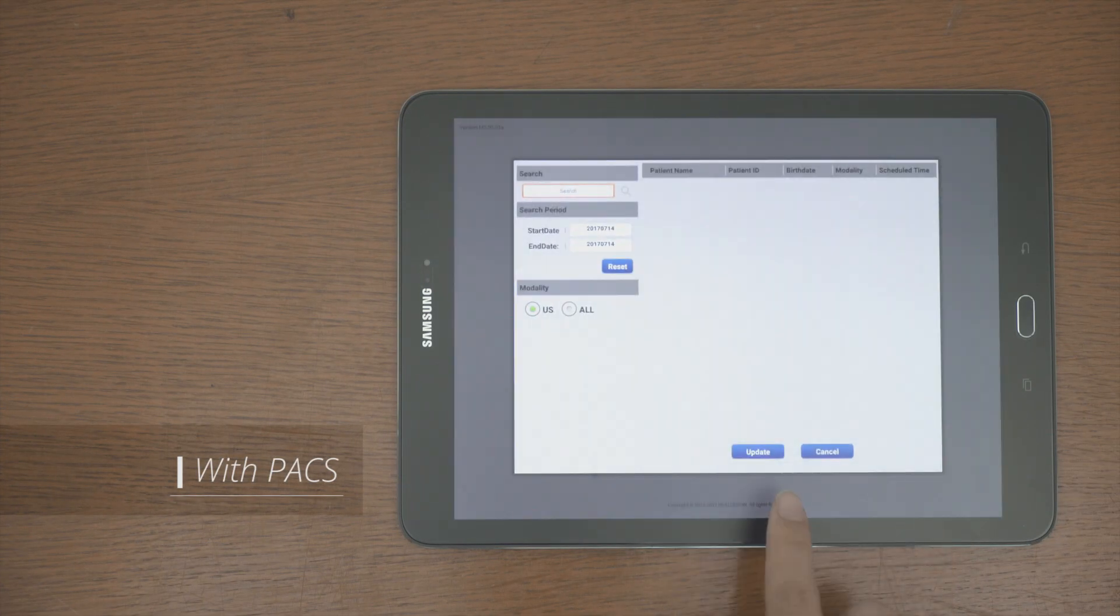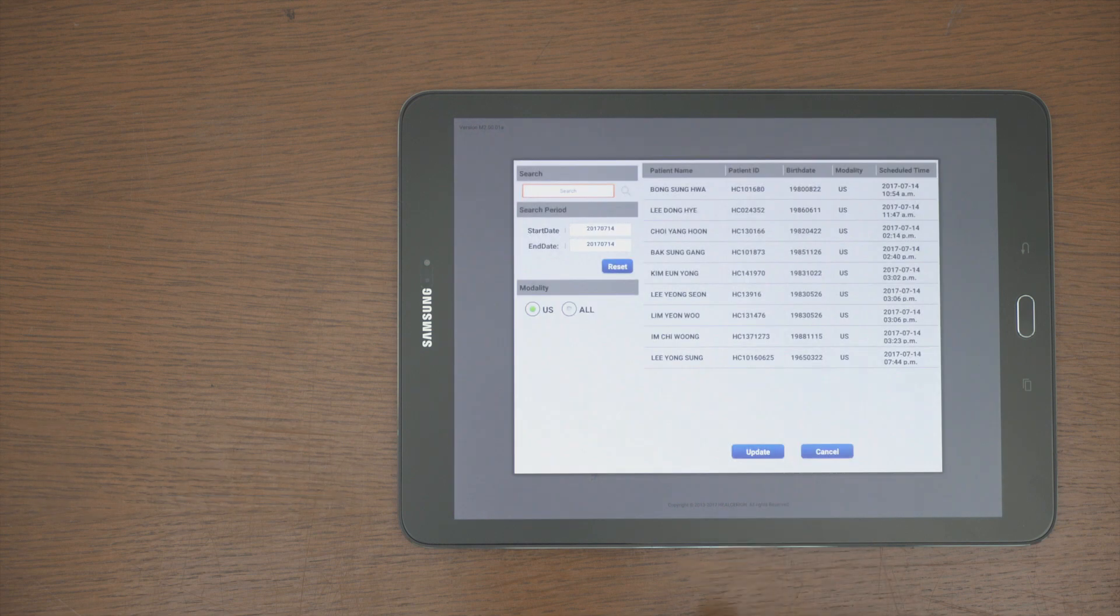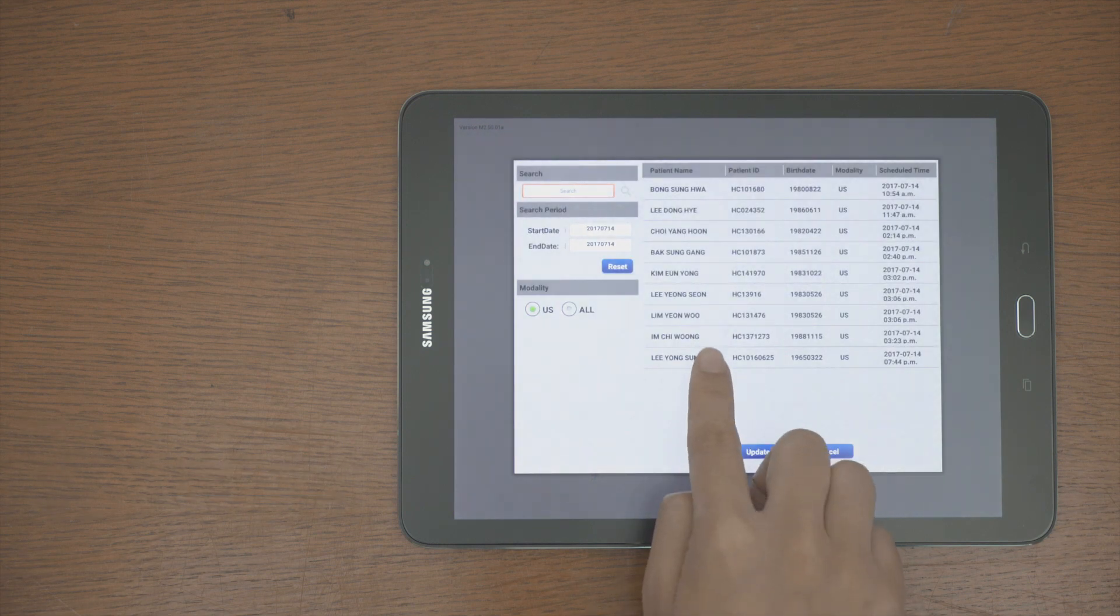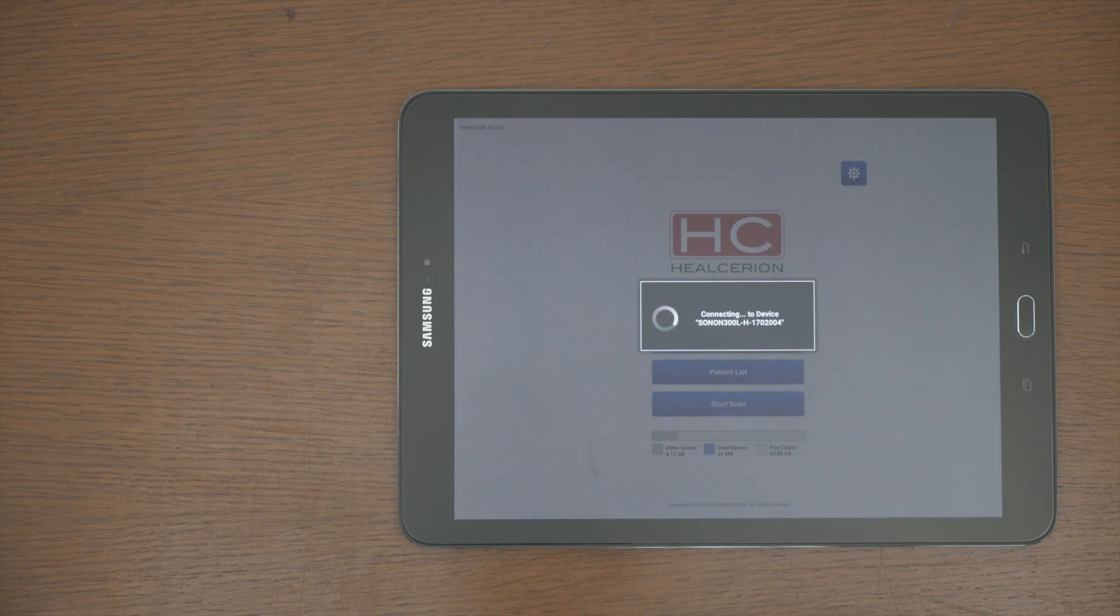Tap the worklist on the Start screen. Update the patient list and find the patient you want to scan. When ready, tap to go directly to the scanning screen.